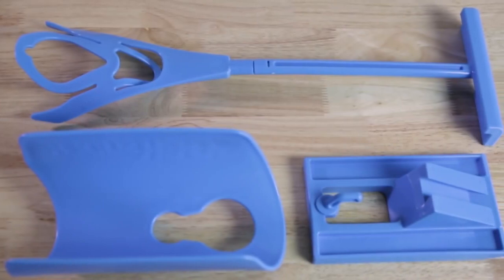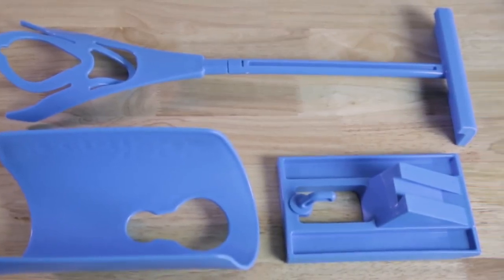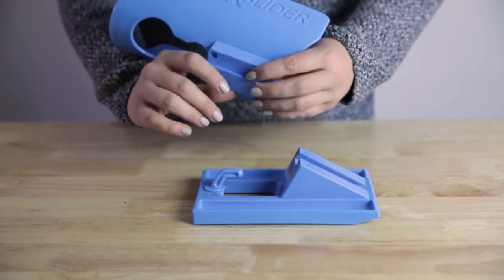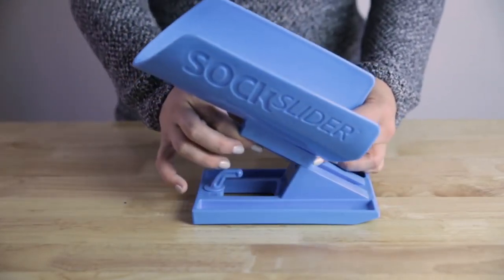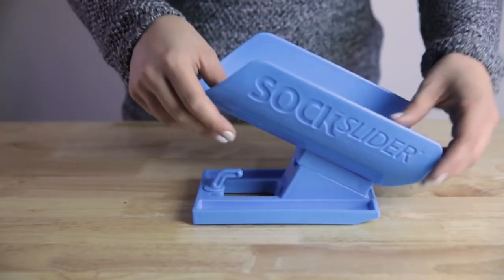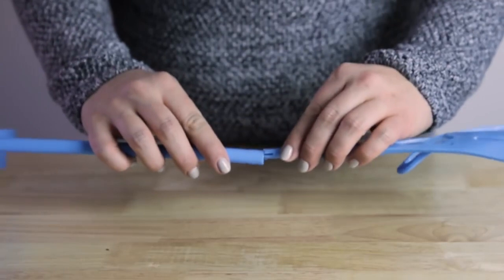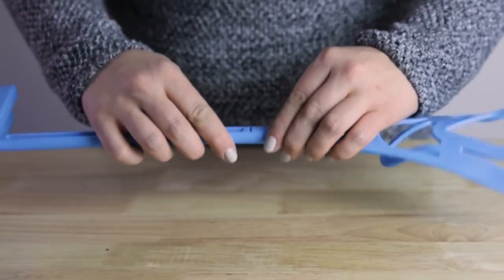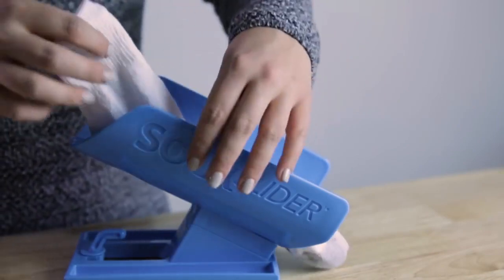Use Sock Slider for the fastest, easiest way to put your socks on and take them off. To assemble, align the sock cradle with the notch in the Sock Slider system's base and gently push down until the sock cradle is in position. Next, firmly push together the two pieces of the handle until it is secure.